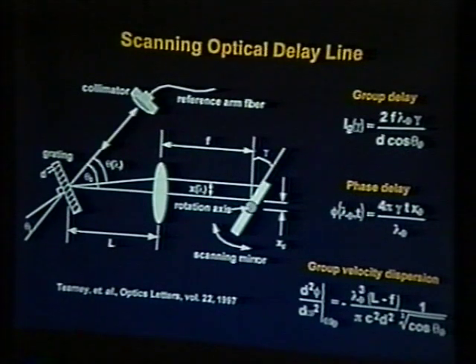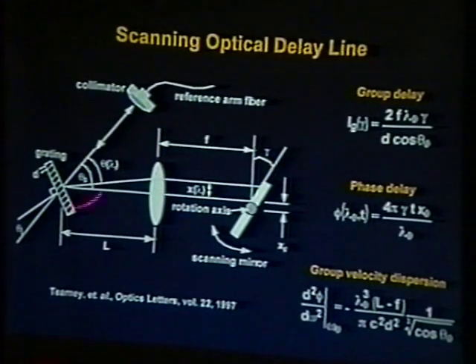Why aren't we imaging at 4 microns for a catheter-based system? It has to do with the transverse resolution. The transverse resolution is basically dependent on the lens or the confocal parameter. When you're up above 10 microns, your confocal parameter is on the order of 2 to 3 millimeters, so over the distance we're imaging, it's almost a collimated beam. When you try to get a resolution down about 5 microns, your beam focus falls off very rapidly, and actually at 5 microns, the confocal parameter is 50 microns.